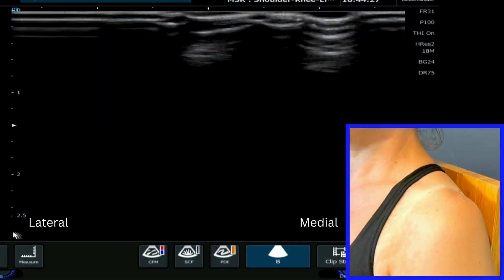This is a video tutorial on how to evaluate the AC joint, the acromioclavicular joint, in the shoulder. This is where the clavicle joins the acromion.